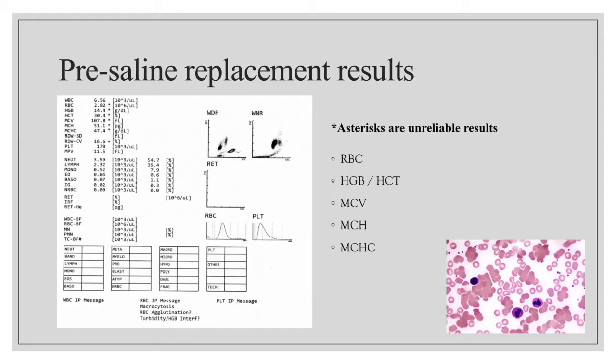The pre-saline replacement results will look something like this. Next to some of the indices there's an asterisk. This is a flag letting you know that these results are unreliable and should not be resulted without further examination. The bottom of the page lists a few error messages such as macrocytosis and RBC agglutination, and upon examination of the blood smear, you can see that the red cells are forming large clumps. These flags indicate that you would need to perform a saline replacement to get accurate results.